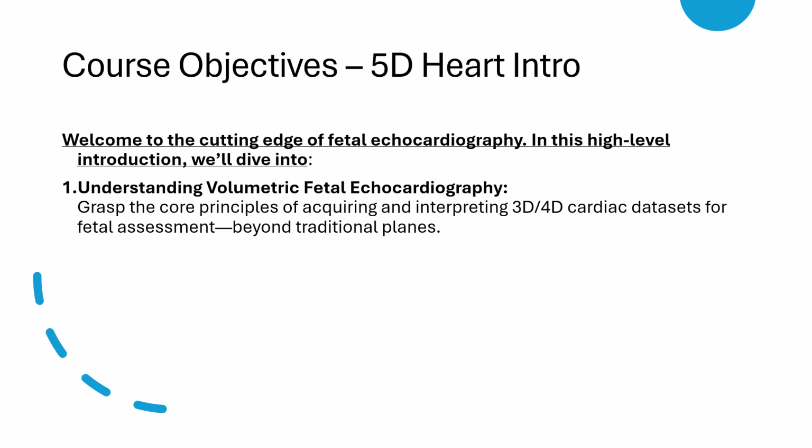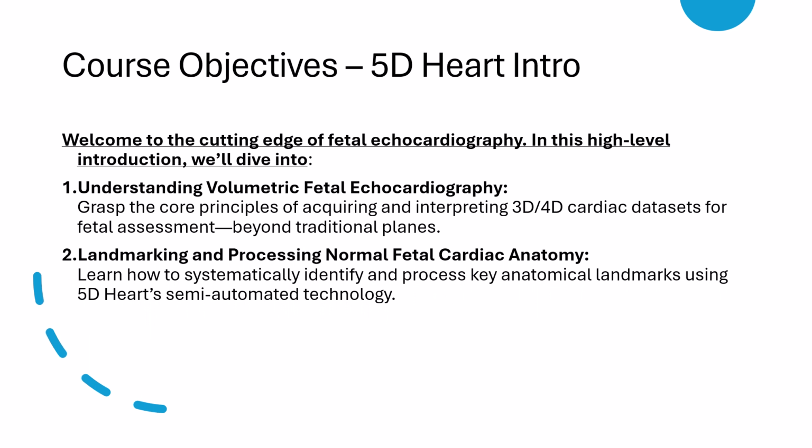Next, we will cover the landmarking and processing of normal cardiac anatomy using the 5D Heart system. We will walk you through how automated tools can help clinicians accurately identify essential structures from chambers and valves to outflow tracts, streamlining both diagnosis and documentation.